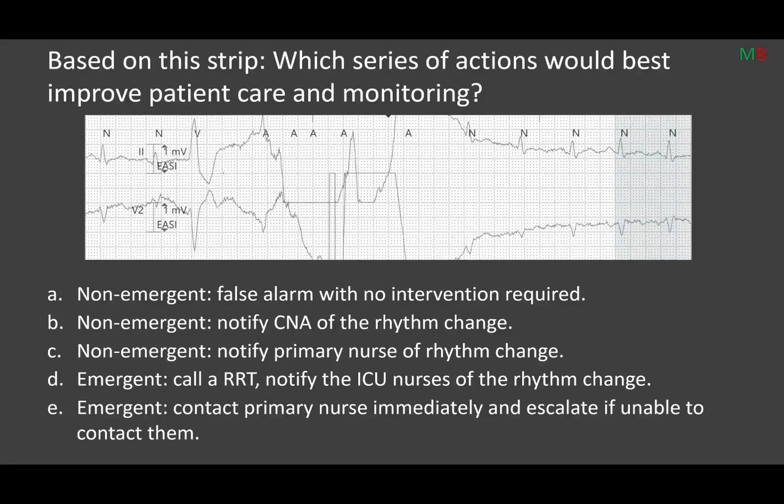Based on this strip, which series of actions would best improve patient care and monitoring? Just by looking at this, you're going to have to be able to tell what rhythm is going on. Based on how wild and crazy that EKG strip looks, I'm going to say that we've likely got a loose electrode.